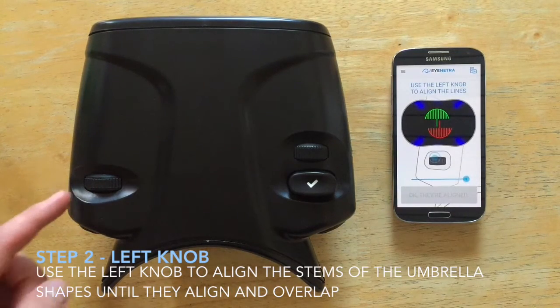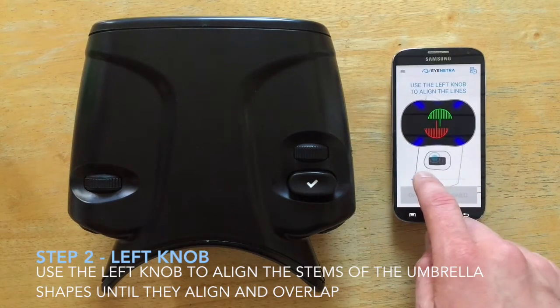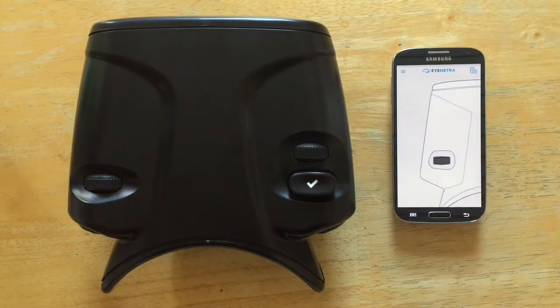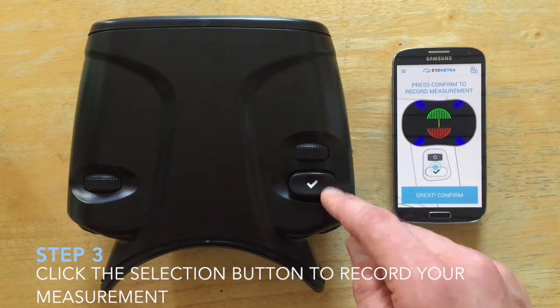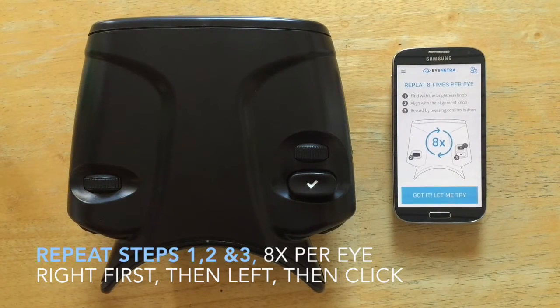Next, use the left knob to align the stems or handles of the umbrellas until they align and overlap. And last, click the selection button to record your measurement. Patients will repeat these same simple tasks — find, align, and confirm — eight times per eye for a total of 16 repetitions.